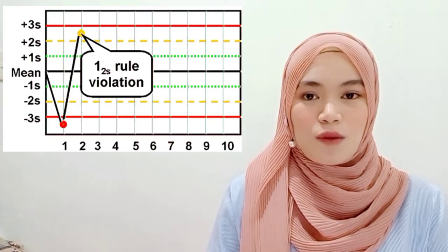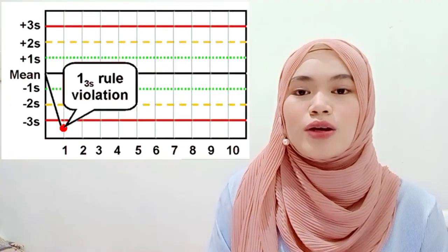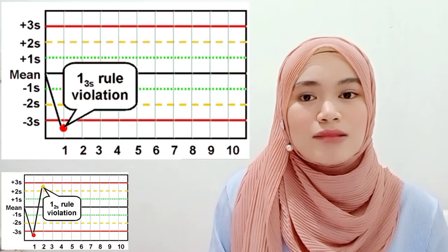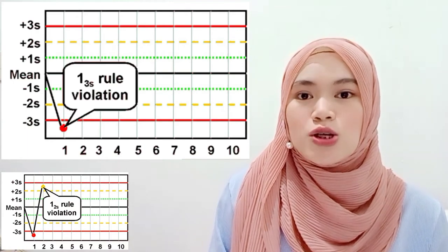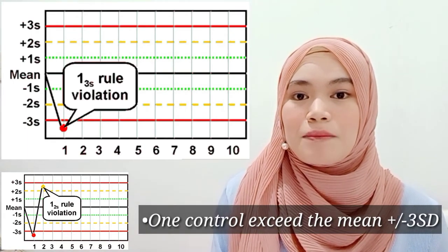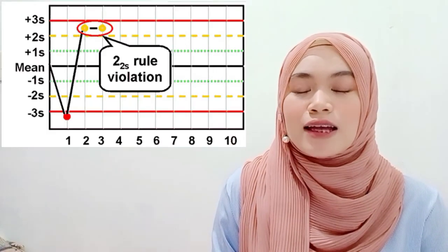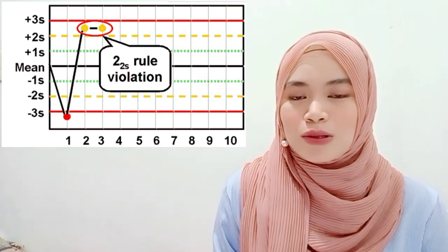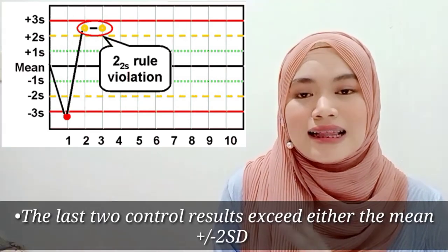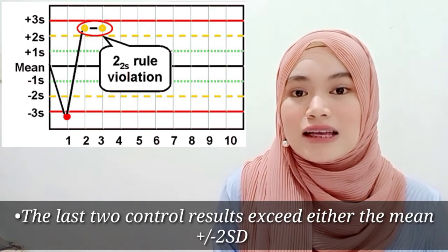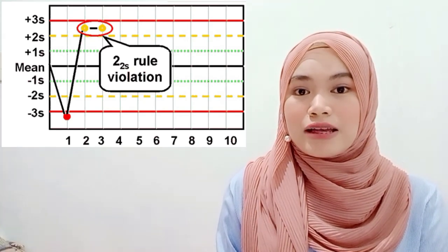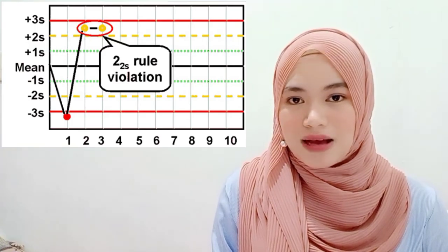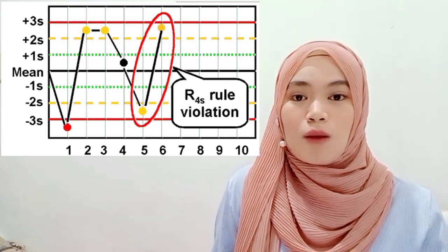The next rule is the 1-3s. In 1-3s, it means that one control exceeds the mean plus or minus 3 SD. It's just the same as the 1-2s — it only differs in the location of control. Next is the 2-2s rule: the first digit stands for the quantity of the control and the lowercase stands for the location. So 2-2s means that the last two control results exceed either the mean plus or negative 2 SD. As you can see on the graph with the red marker, it really shows the last two control results exceeding either the mean positive or negative 2 SD.